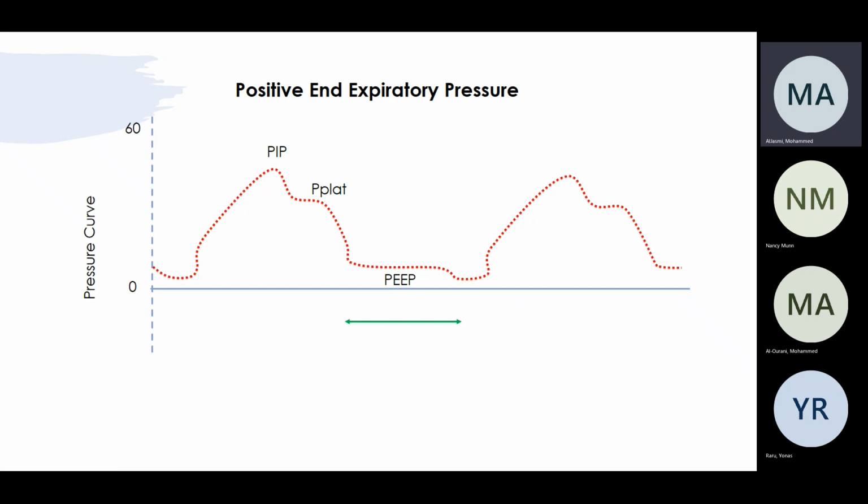Is that the actual PEEP that we are giving, the 5, or should we look at different things? We can add, so the total pressure we added. So EPAP 5 plus 5, that's 10. What's that? Right, Katie. Anything else?